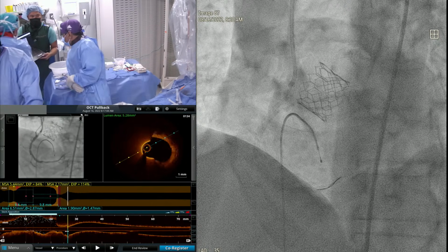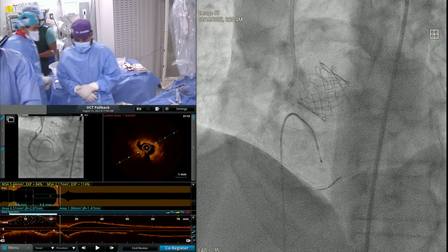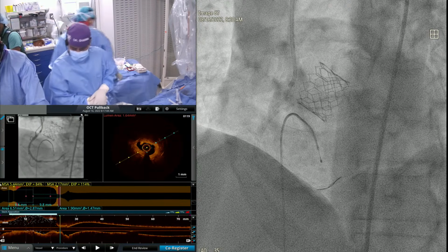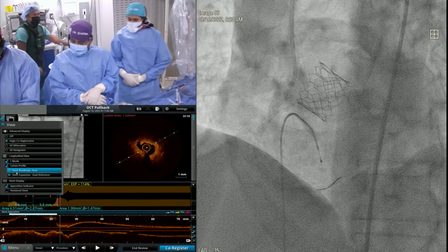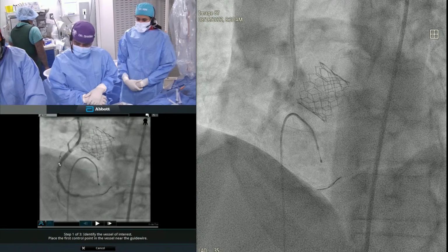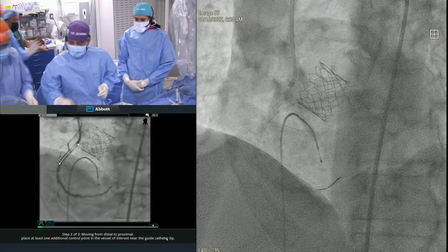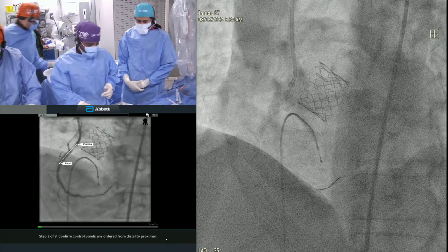Compressed by the balloon. Nice picture. These sizes have recently changed. Before, it used to be even a 2.0. It used to be Spectranetics, which had made even a 2.2 and a 2.4 in 1987 or 88, I remember. And of course, that was removed.